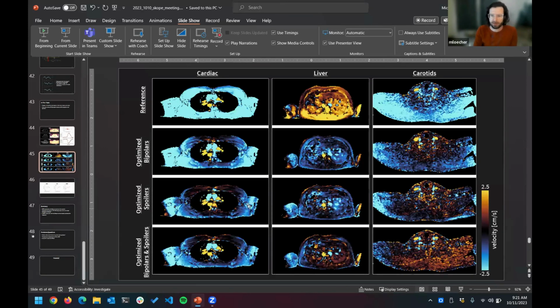You could hope that because we're defining everything at isocenter, and most of the vessels we care about are going to be at isocenter, the B0 is maybe good enough. But all the literature on, let's say, the polynomial corrections says you need at least a linear fit. So I would say it's not complete without having the linear term as well. It just wasn't in the scope of how we decided to do the project right now. We wanted to pick one to get as good as we can and then add linear after. So that's where we're at.